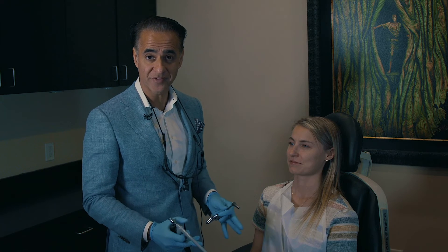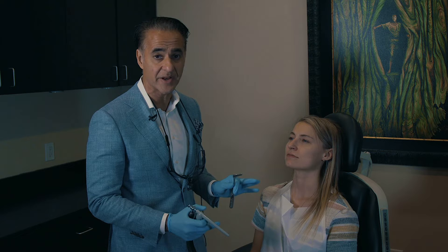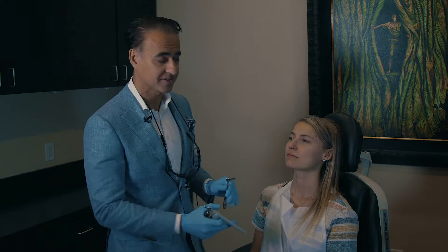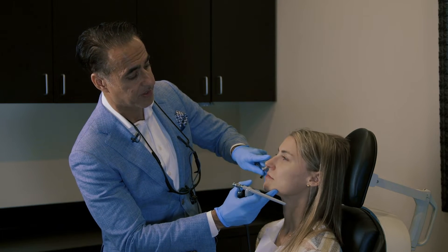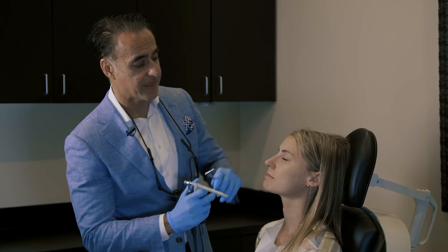We're going to walk you through the different steps of nasal cauterization. The first thing we're going to do is — since she is bleeding from the right side of the nose — spray the nose to numb it up and also to decongest. This is done very easily, just a couple of squirts and that's it.